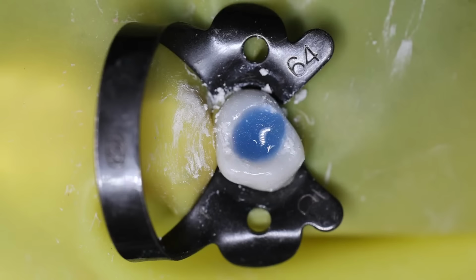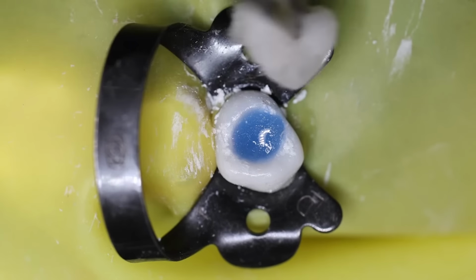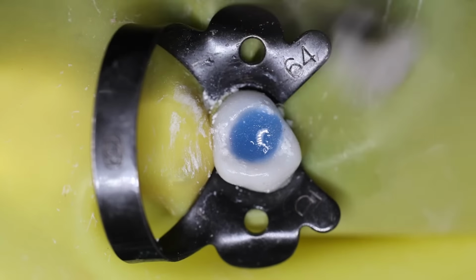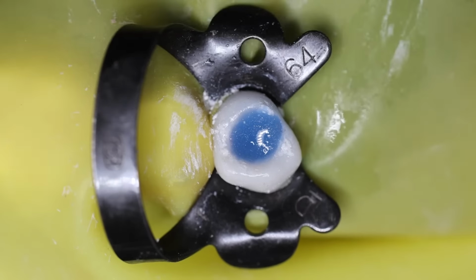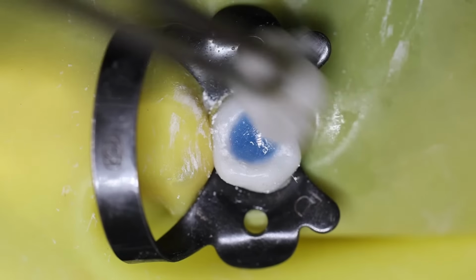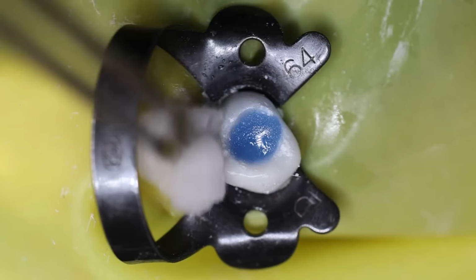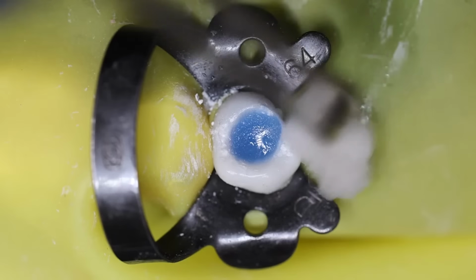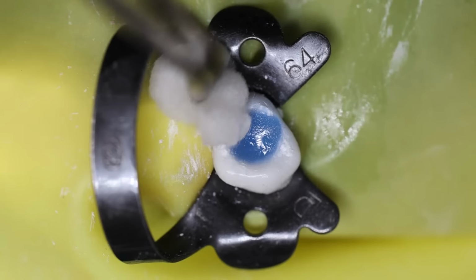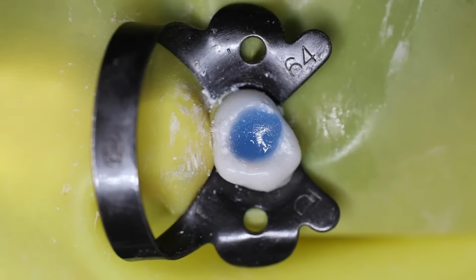So we will use cotton to clean up the things. So here we are done.